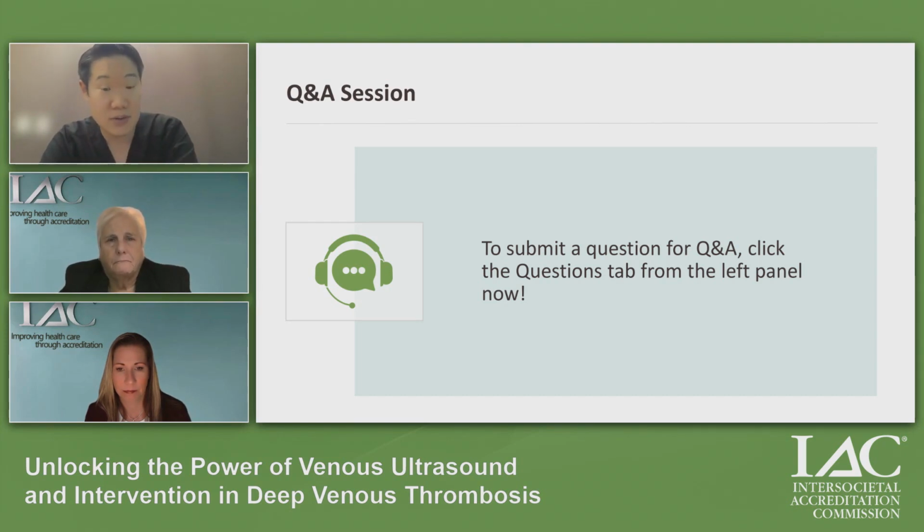of that because with acute DVT, I'll tell you, I have seen DVT move when I am in the veins. Like I literally have watched a DVT that was here move there because it was so acute that it was slipping and sliding around. And so, yes, people get concerned about augmentation or even compression. So if it's truly acute, okay, that might be a setting where I would be wary of that. But we are in an era where we can much better tell the difference between acute versus chronic DVT.